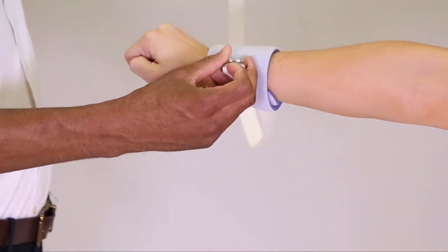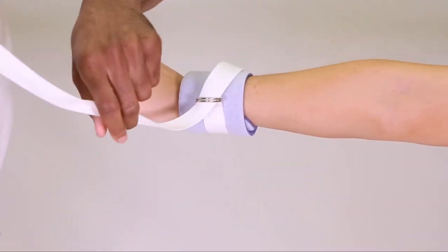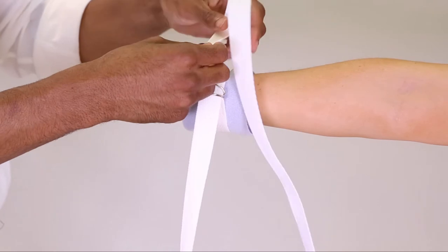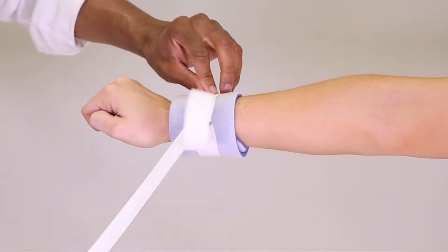Take the strap and feed it through both D-rings and pull. Take the end of the strap and feed it back through both D-rings and pull.